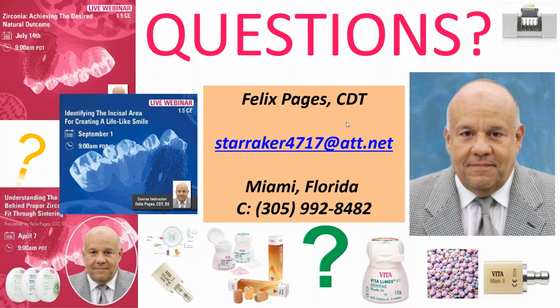He did it in his lecture at the FDLA meeting, the steps that he went through. So basically, you need rubber impregnated or diamond impregnated rubber wheels or silicone, whatever it is. And I use like 3 grits, a coarse, a medium, and a fine. And then I use those little spiral wheels that are also diamond impregnated. On my occlusal surfaces, I never put glaze on those.